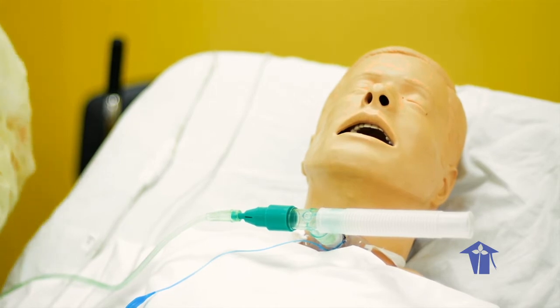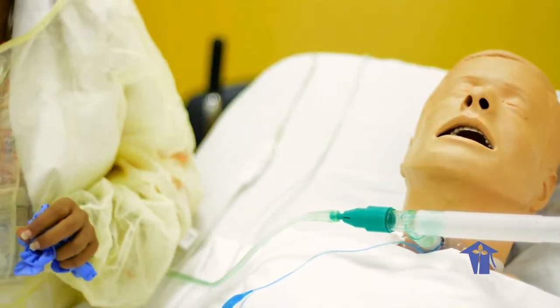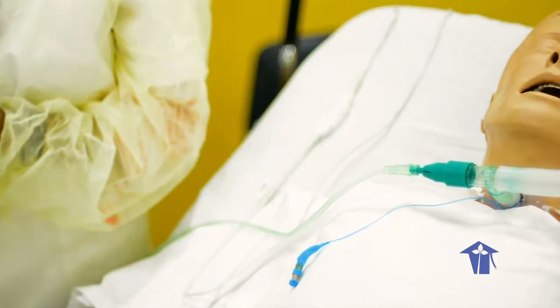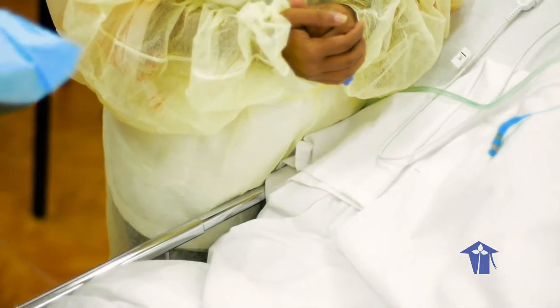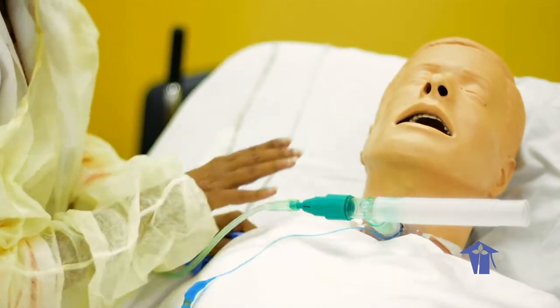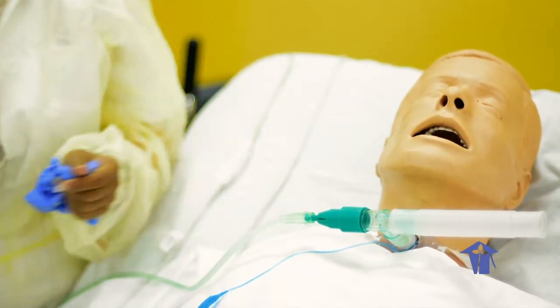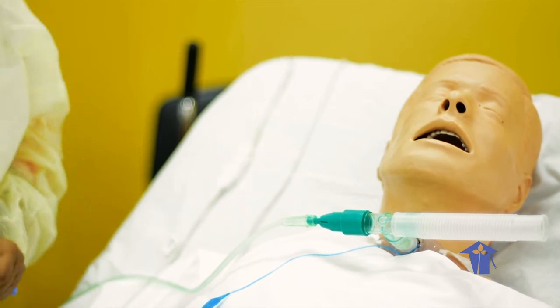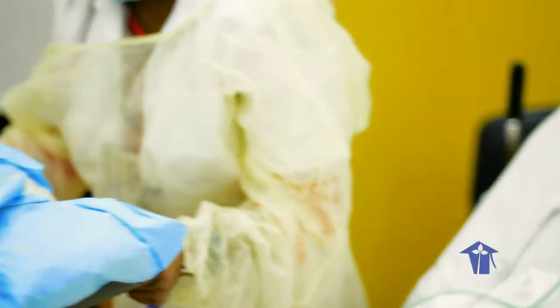Adjust bed to comfortable working position, usually elbow height of the caregiver. I fix the bed a little bit for my comfort, for me to work better. Lower side rails closest to you. I'll lower the side rails. If patient is conscious, place him or her in a semi-Fowler's position. As I adjusted the bed, I know by looking at your oxygen saturation that you're getting adequate oxygen in the position that you're in. If patient is unconscious, place him or her in a lateral position facing you. Well, I know you're very conscious, Mr. Black. Move the overbed table close to your work area and raise to waist height.